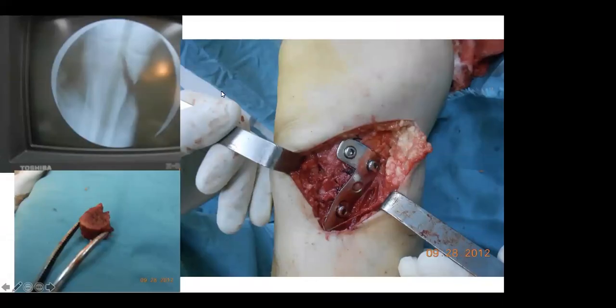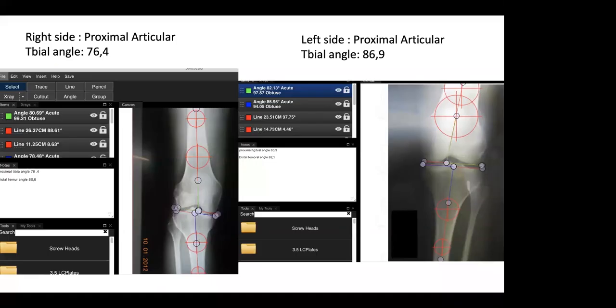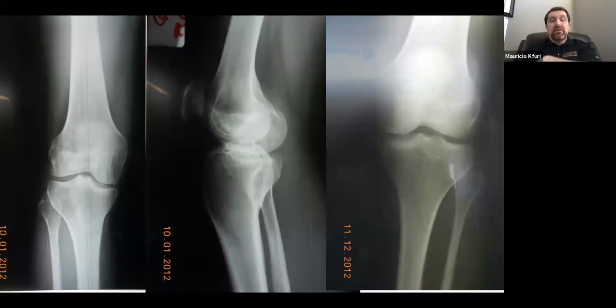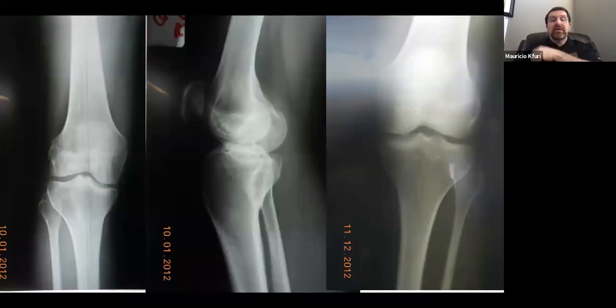What about the inclination, since there was depression posteriorly, and he shows the coronal plane correction, but it's a little bit difficult to tell. It doesn't look like it was necessarily used to correct the posterior slope based on which direction the osteotomy was. Yeah, I would say if you look at this lateral view specifically that you're showing right now, it's possible to see that the anterior quadrant of the medial plateau looks leveled.